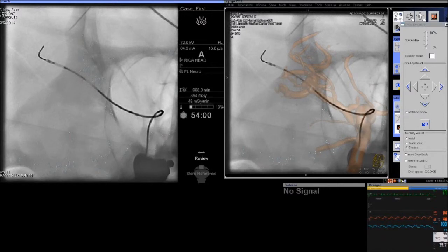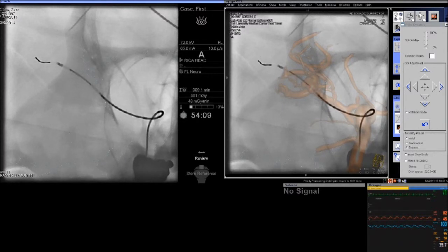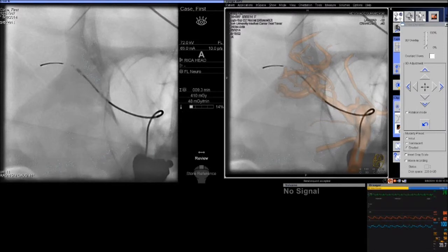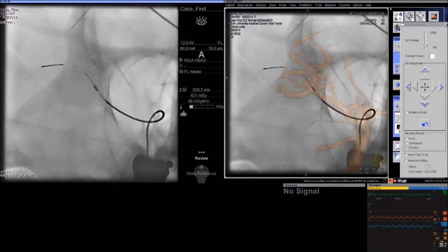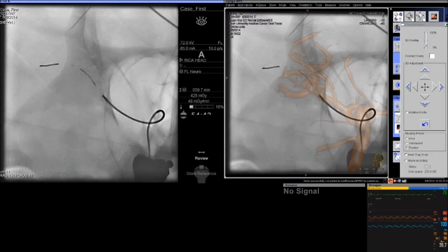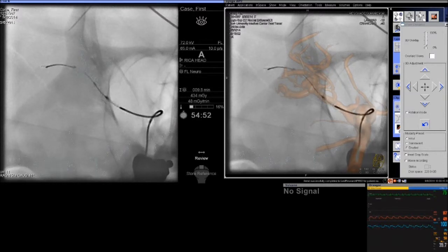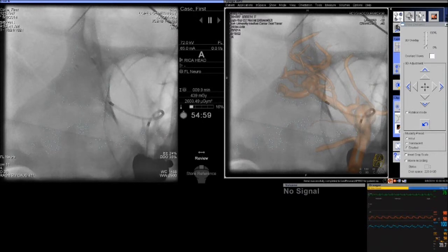You can see that the 3D roadmap is somewhat deformed, but I still prefer having the fluoroscopic view on the left side to see exactly where the device is being deployed. With this fluoroscopy, I was comfortable that even with some 3D distortion, there was a significant size mismatch between the stent and the aneurysm neck, allowing me to use bone landmarks and the 3D roadmap to deploy the first stent. We were careful to achieve good purchase into the middle cerebral artery M2 segment with very little coverage of the M1 segment, to avoid overlapping multiple devices along a long M1 segment.